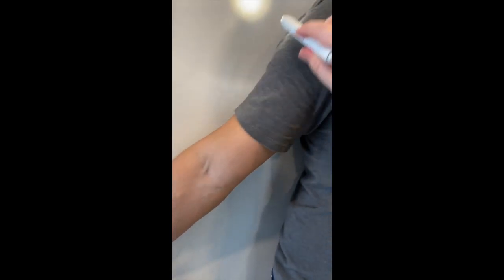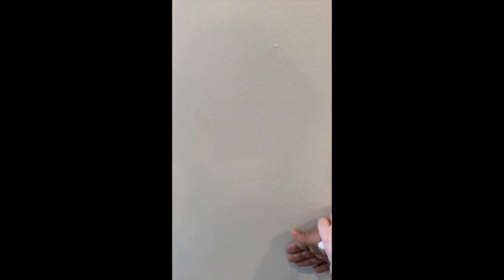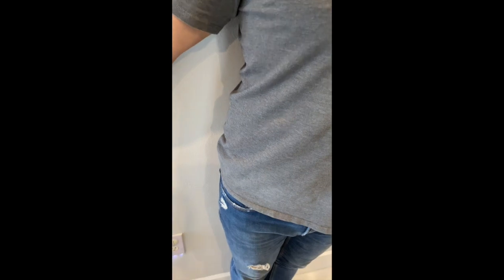The border is going to start here, on the way up to include the elbow joint. You want to make sure that the hand is located externally for it to be in a true AP, and then the exposure is taken.